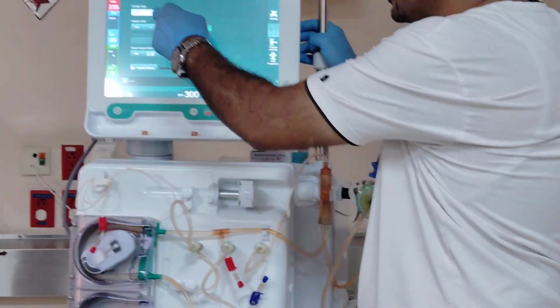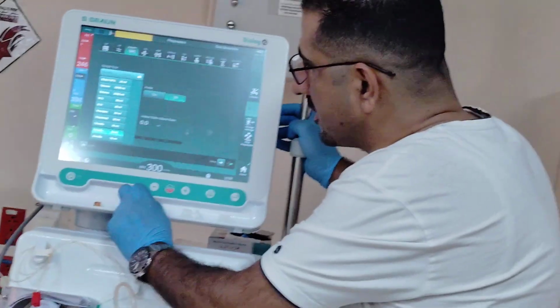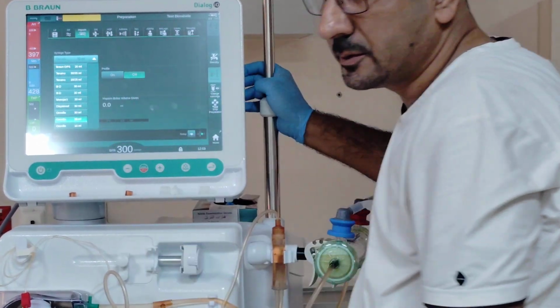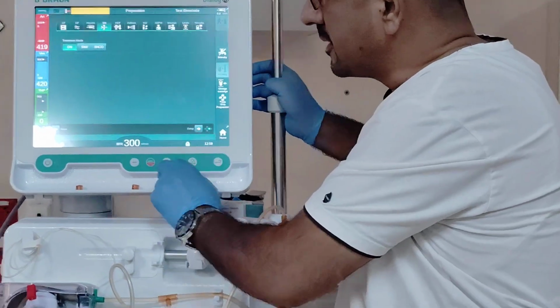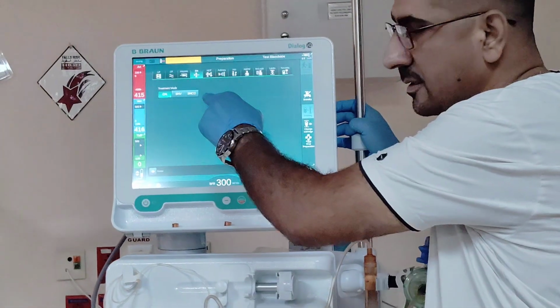And from here you can change the syringe type of therapy. So here we have 10 ml, 20, 30. This is for the single needle therapy, and as you know, we have single needle valve and single needle crossover.